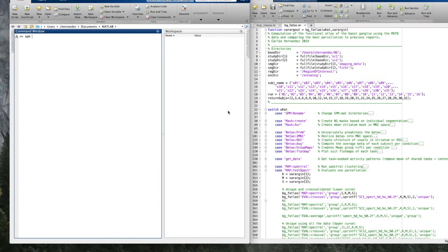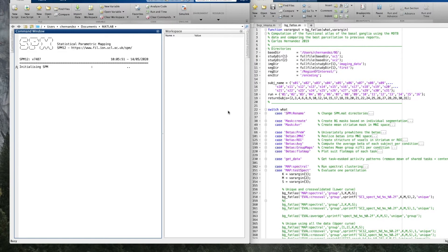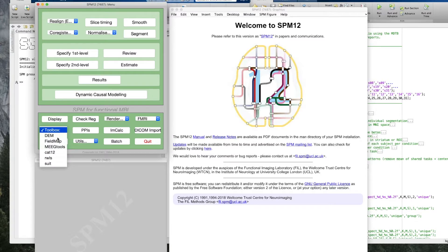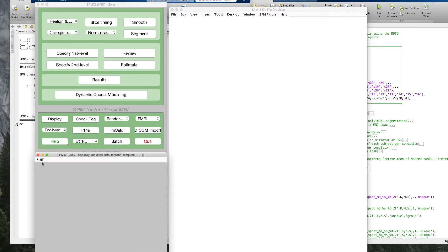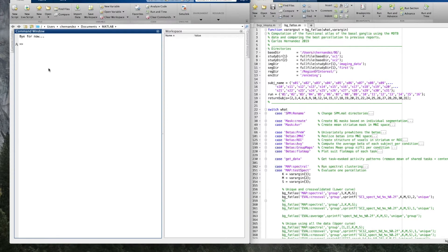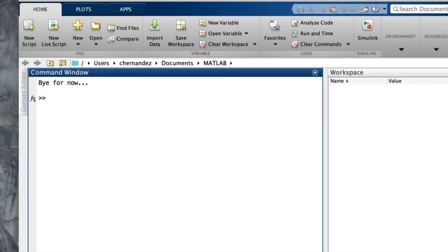Although Soot comes with a graphical user interface, we will explain the functions using the command line. In this way, you can create your own scripts to automatize your pipeline. This is helpful, especially when you need to run several subjects.